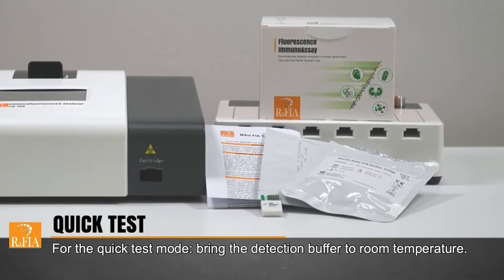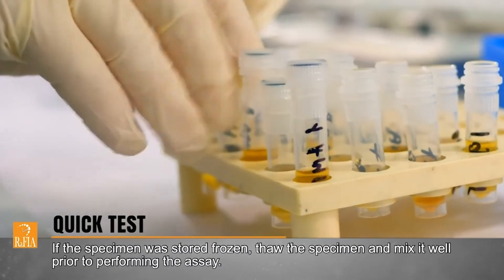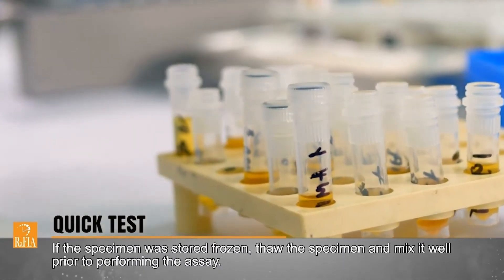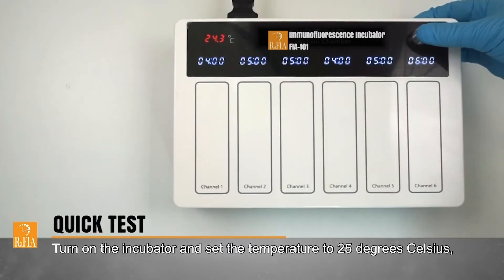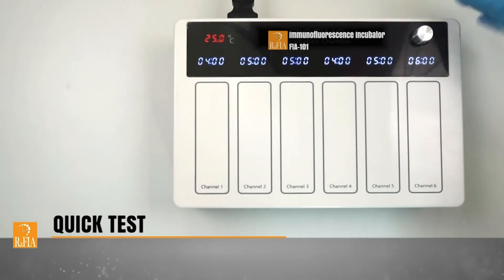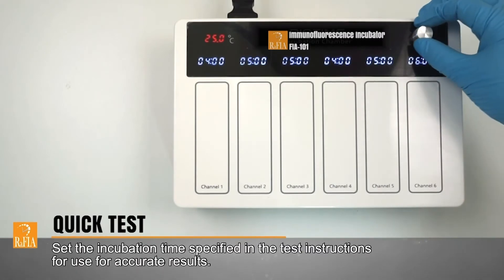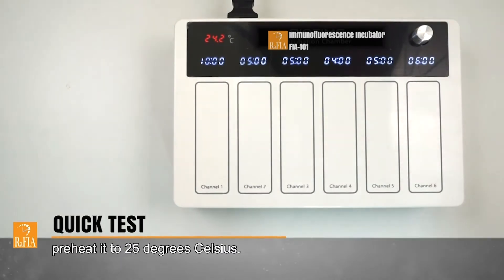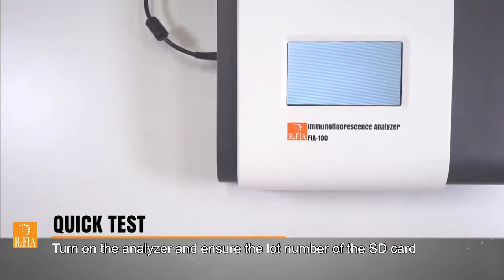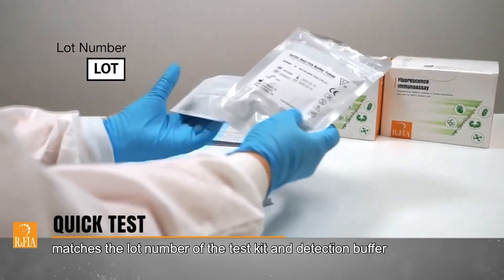For the quick test mode, bring the detection buffer to room temperature. If the specimen was stored frozen, thaw the specimen and mix it well prior to performing the assay. Turn on the incubator and set the temperature to 25 degrees Celsius. Set the incubation time stated in the test instructions for use for accurate results. Reheat it to 25 degrees Celsius. Turn on the analyzer and ensure the lot number of the SD card matches the lot number of the test kit and detection buffer.